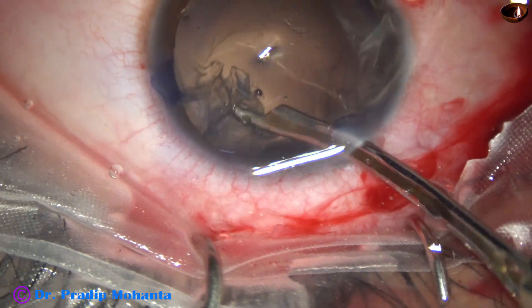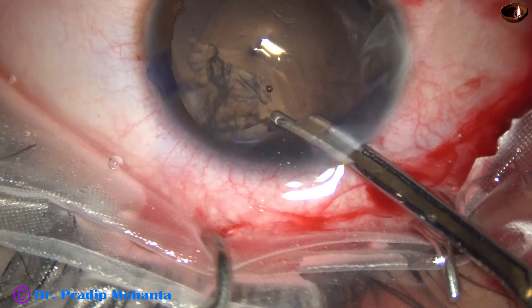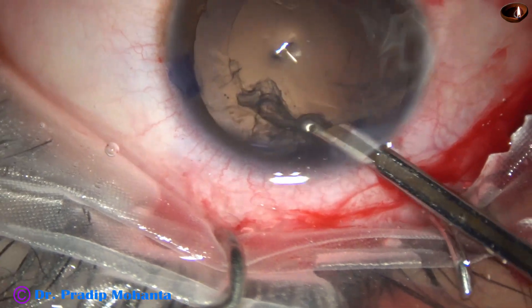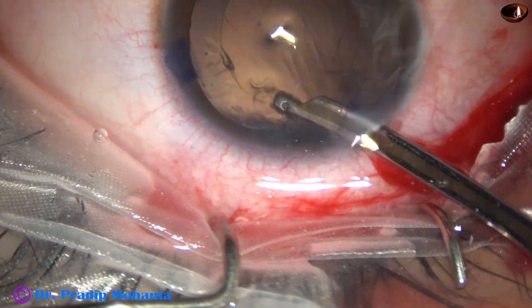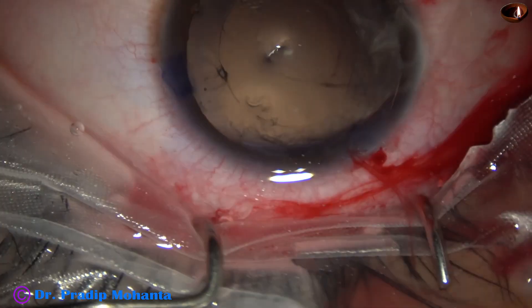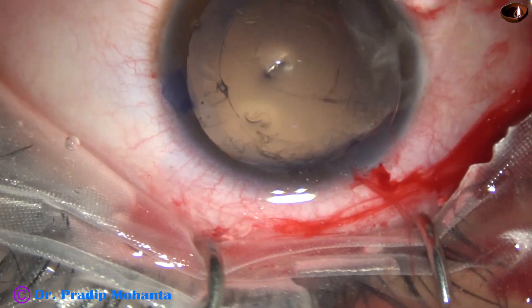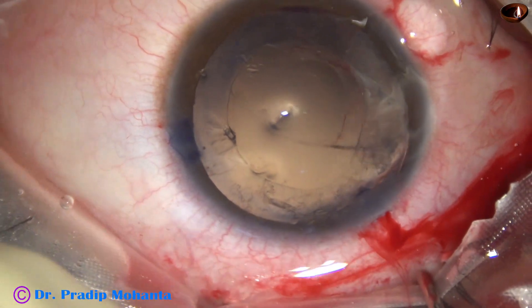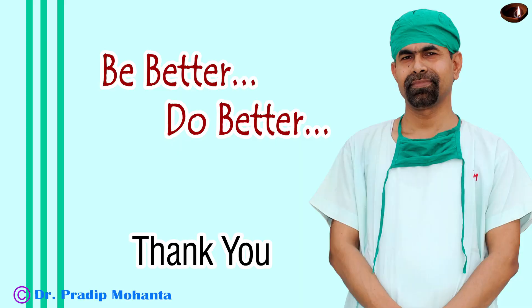I am doing dry aspiration — without irrigation, I am trying to aspirate this cortex and I could do it. I have been able to aspirate the lens matter without hydrodissection. Thank you very much for your attention.